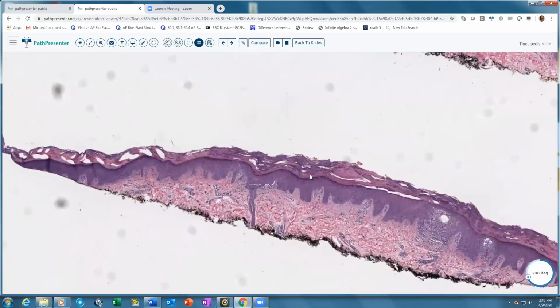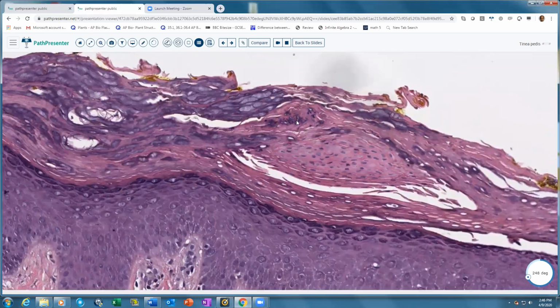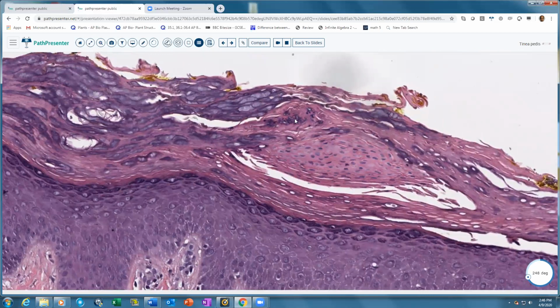But in this one, I think we can even see it on the H&E. So you can see the fungus here actually. And the other feature that many books will also talk about is the sandwich sign. By the sandwich sign, they mean the orthokeratosis that you see here, the orthokeratosis and the parakeratosis and the orthokeratosis. So this is like a sandwich sign where you see the fungus in between them actually. So you see ortho and parakeratosis in between layers of hyperkeratosis.